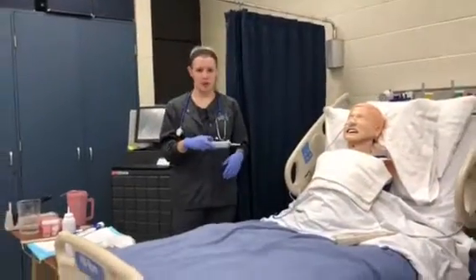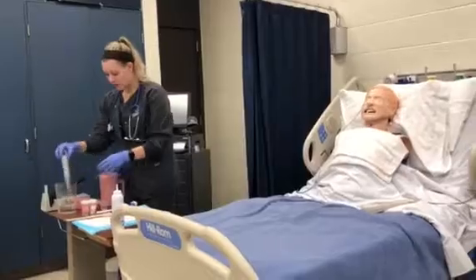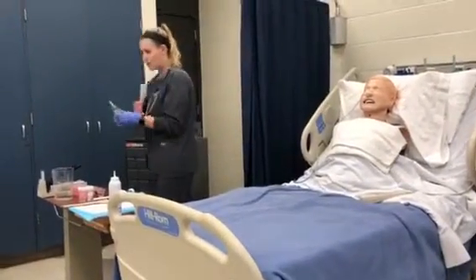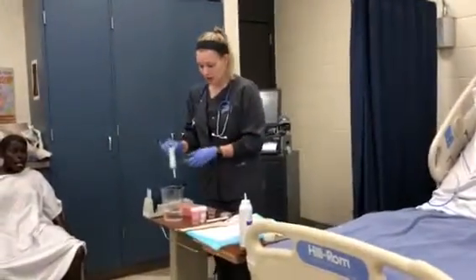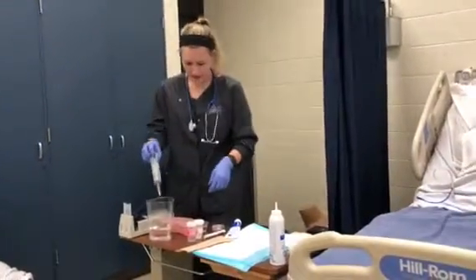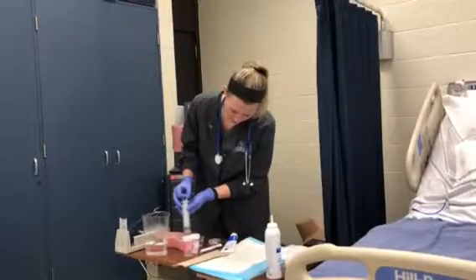And always put your residual back too, because those are their nutrients. So what we do first is we flush, which I already have set up, and we've checked for placement. So now I'm going to flush with 20 mils of water, which I already have in my little cup set up, so it's a lot easier.